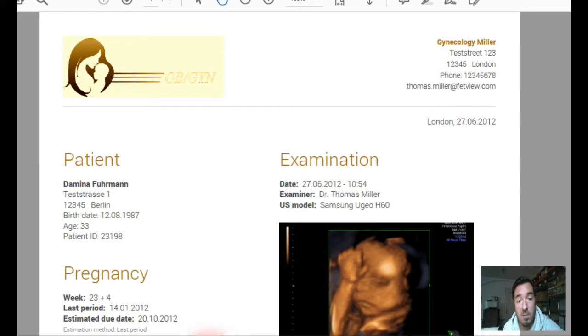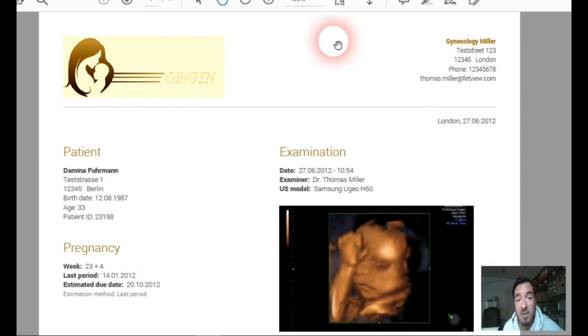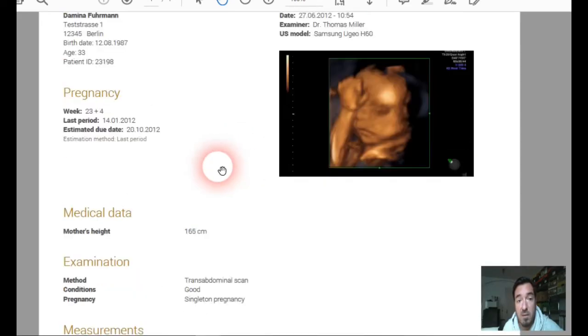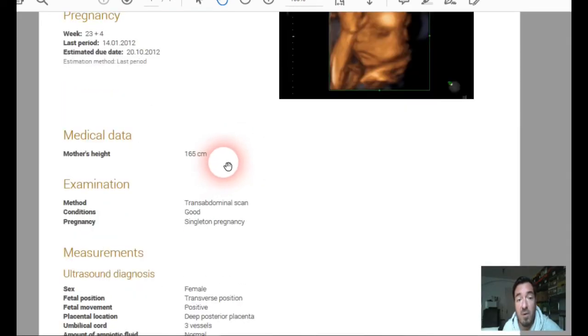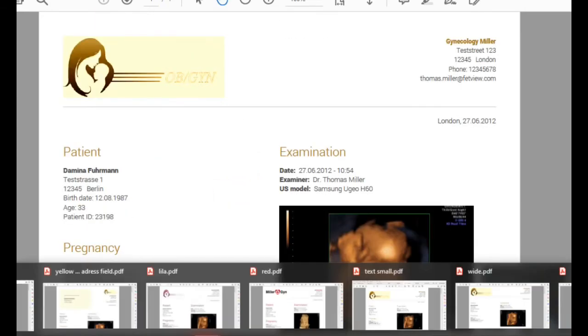And here we have a small text, so your report is more compact.